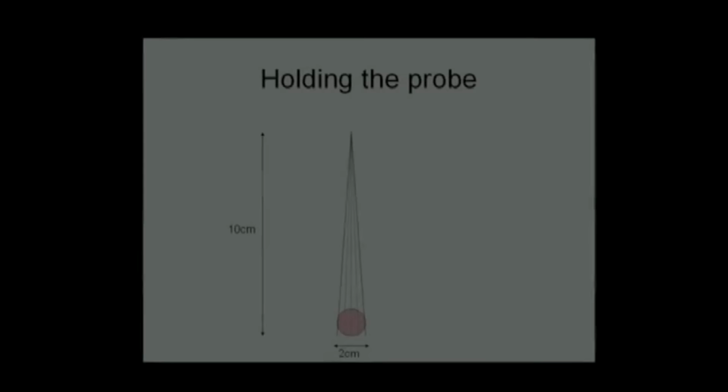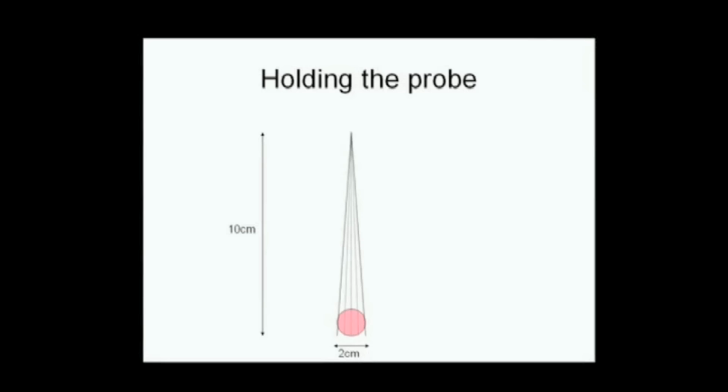When you're scanning the fetal heart, just think about how little you have to move the scan probe to get the views required. The fetal heart at 19 weeks is less than 2 centimeters long from below the four-chamber view to above the aortic arches. The heart, as illustrated in this sketch, might easily be 10 centimeters away from the probe. So a total movement of 10 degrees will cover all five views. As such, a movement of only about 2 degrees will go from the orientation to the four-chamber, and 2 degrees more from the four-chamber to the aortic outflow.